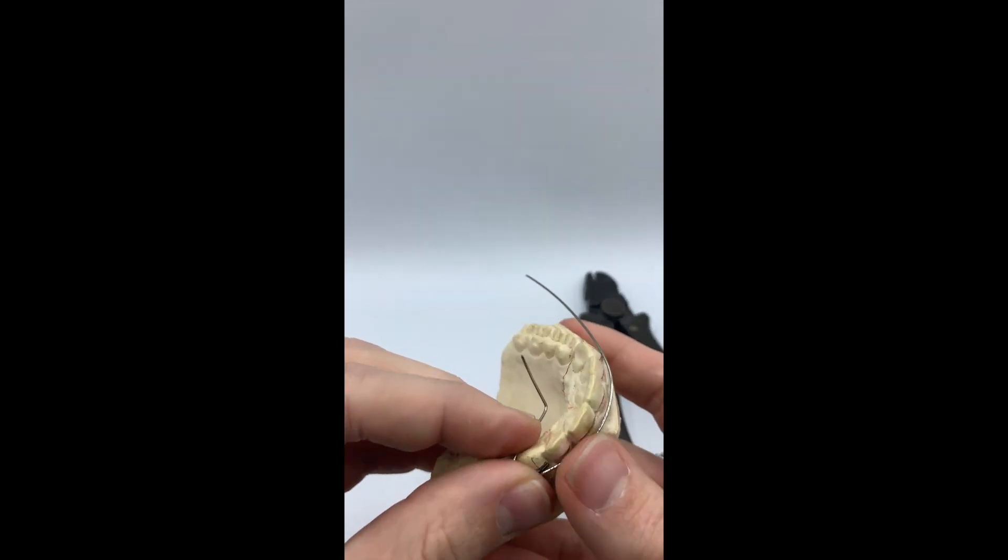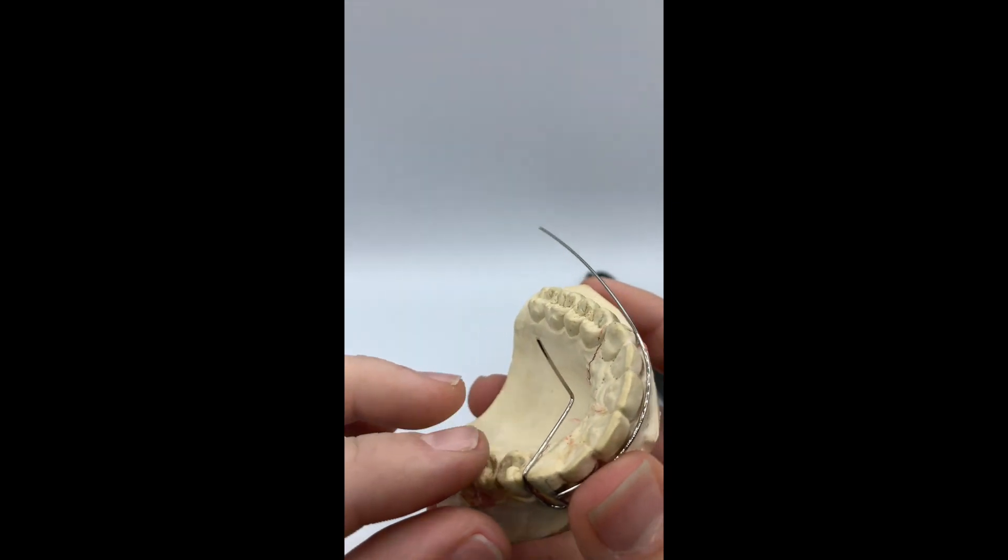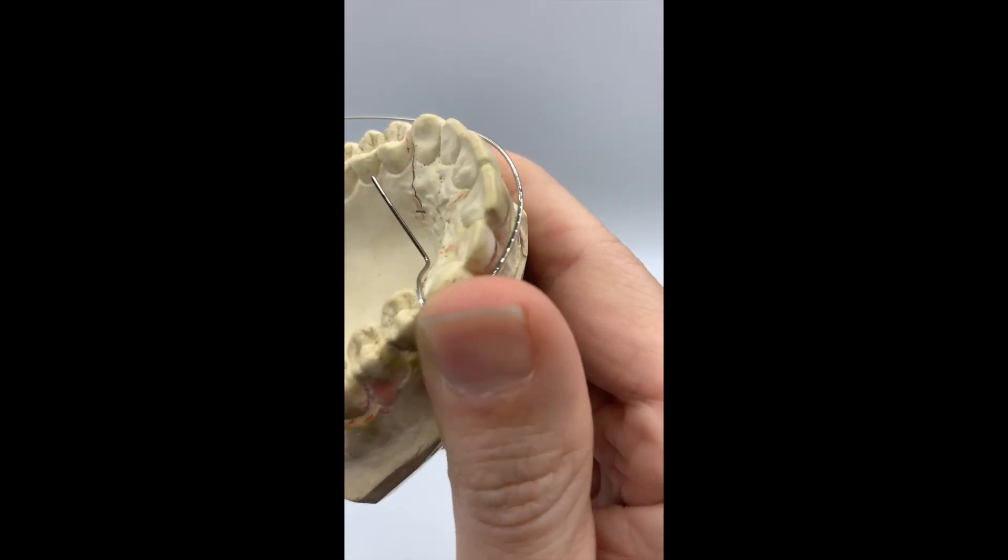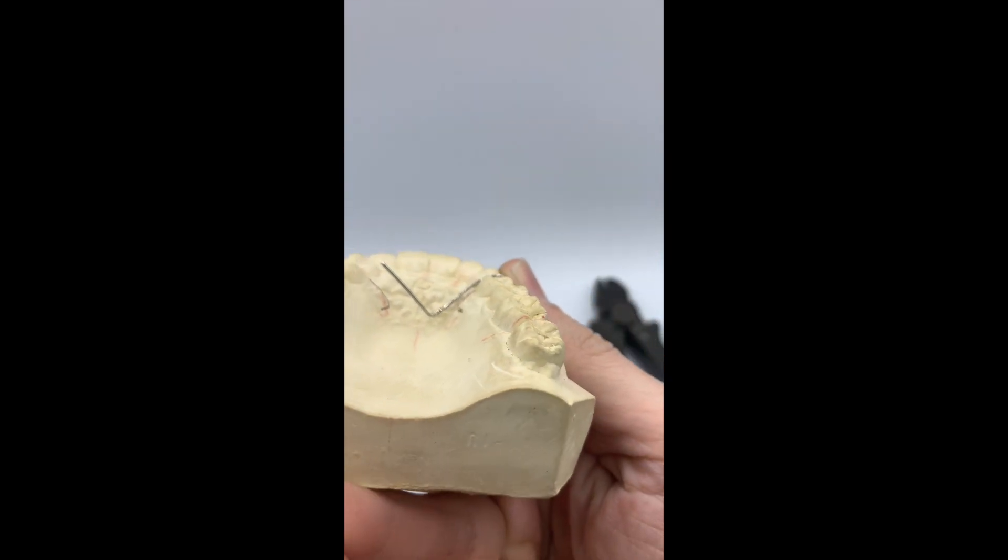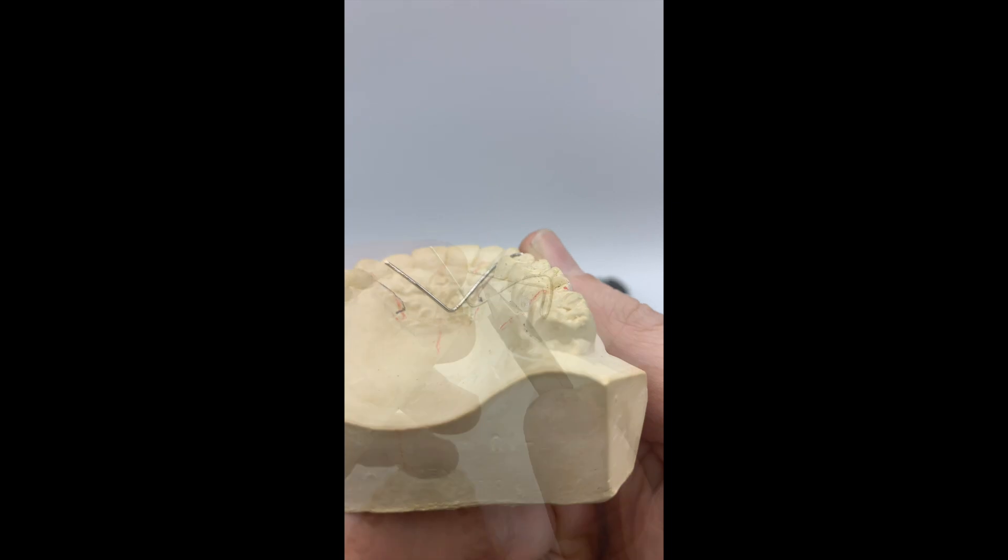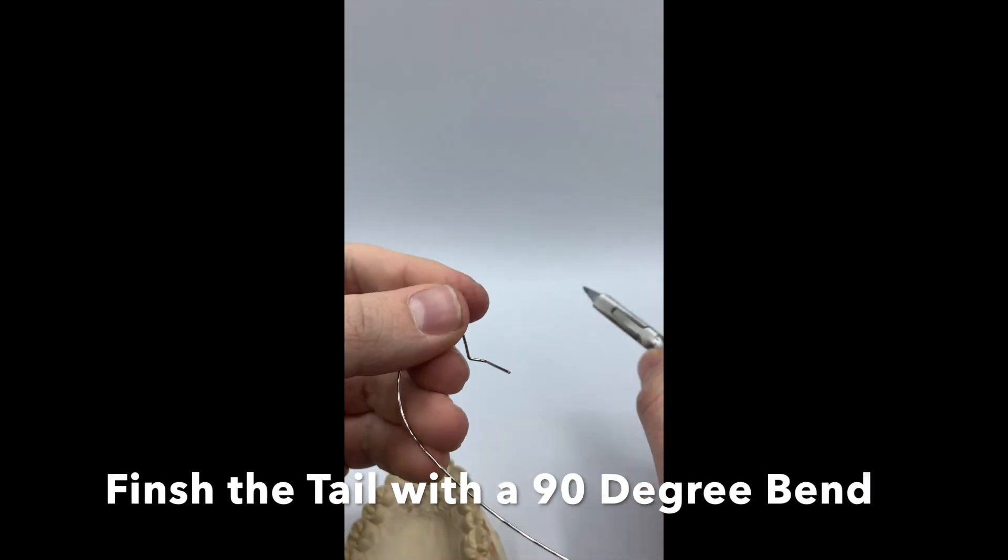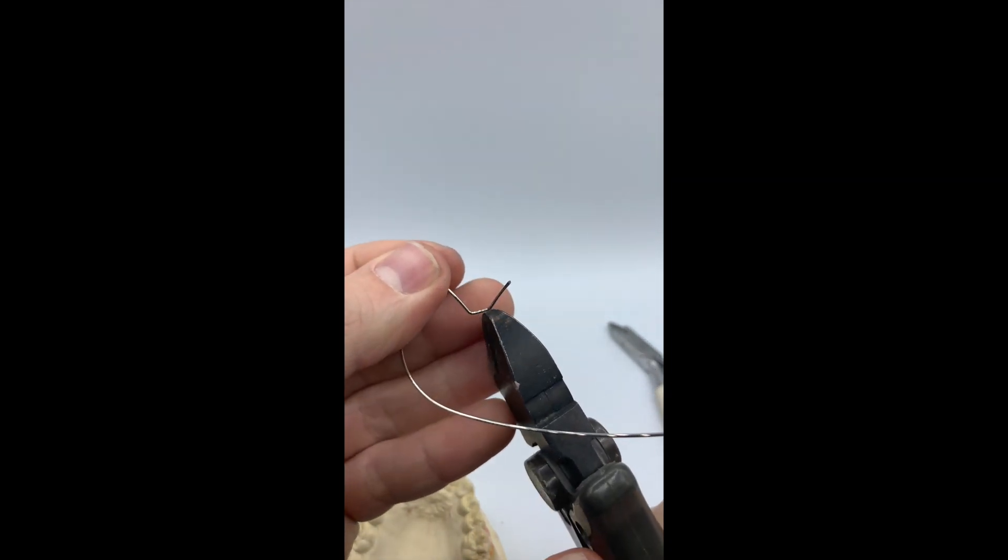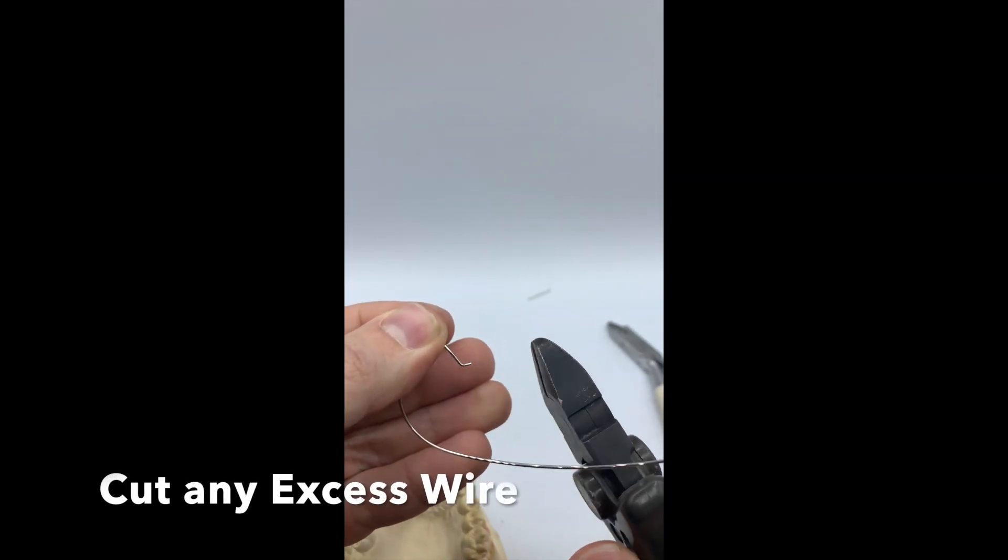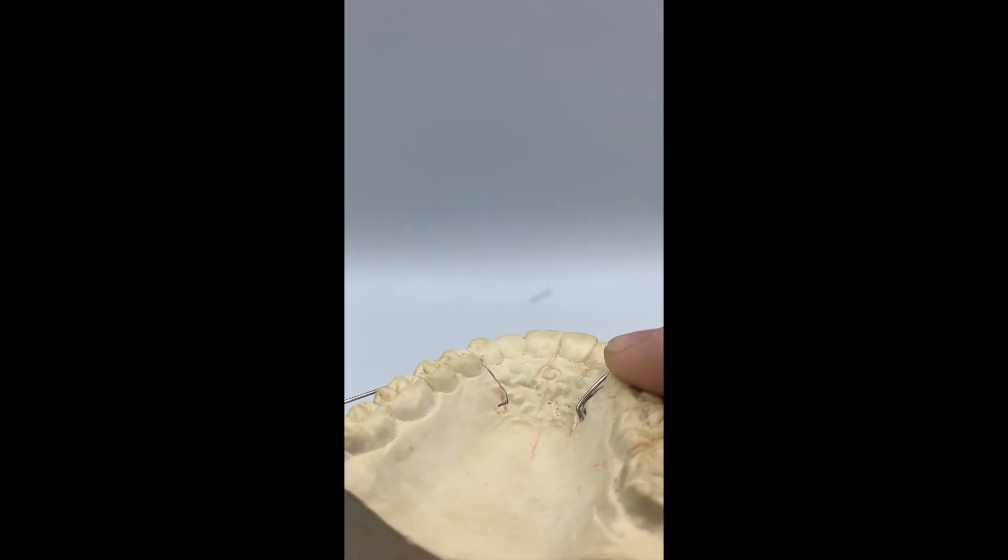If you bend a wire too much in one spot, back and forth, the wire can break. Think of this as like a paper clip. When you have the wire bent into the pallet, a little bit above the tissue, you now want to bend a 90 degree back towards the distal. You want to cut any excess wire with a wire cutter. Be careful, the wires will fly.